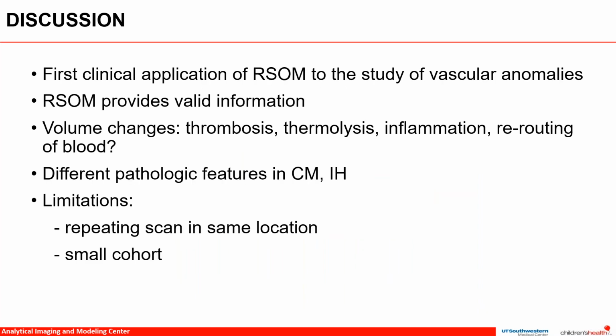Based on these results, we have a few discussion points to make. This is the first clinical application of Rsom to the study of cutaneous vascular anomalies, such as capillary malformations and infantile hemangiomas. Additionally, Rsom provides valid information that can be expanded upon to provide clinically useful information.